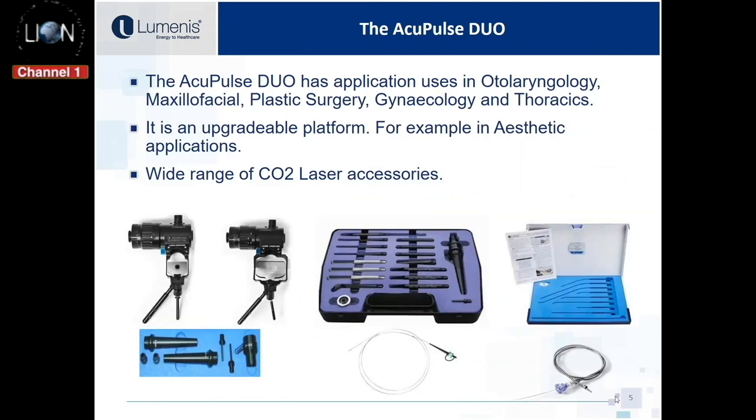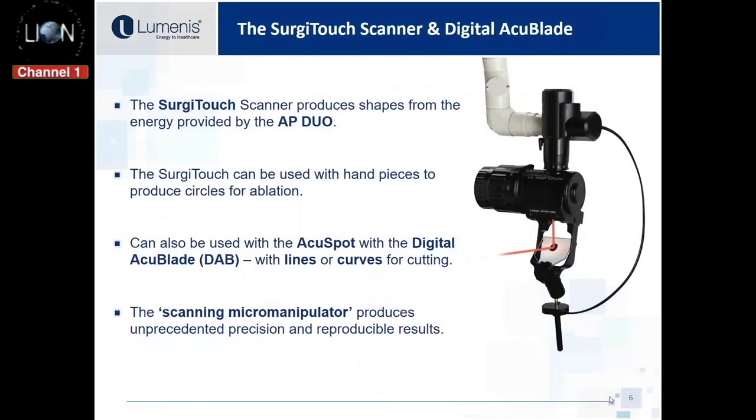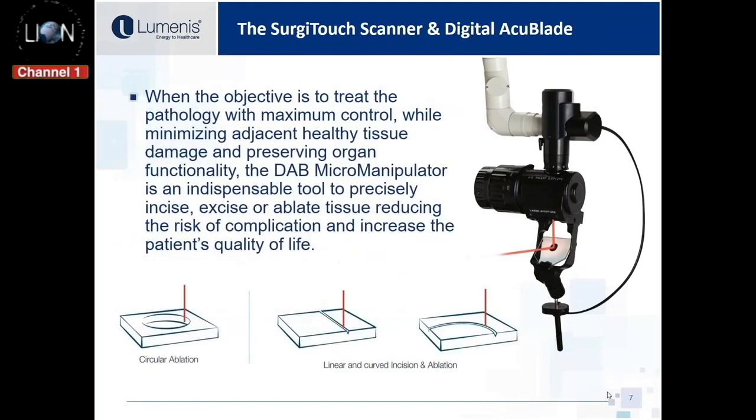So let's start by talking about the CO2 laser system that was used in today's surgery. The system itself has two main modes of operation, utilizing free beam and fiber-based technologies. The free beam, the energy is delivered through the articulated arm in conjunction with the operating microscope or the handpieces. When using the operating microscope, there's a choice of three AccuSpot micro manipulators, and that depends on the model of operating microscope that you're using in surgery.